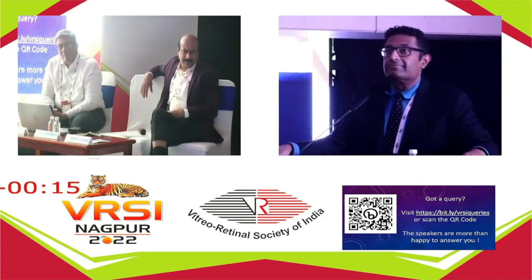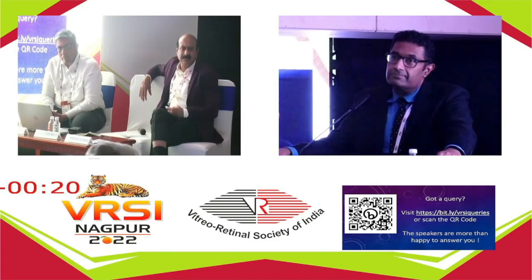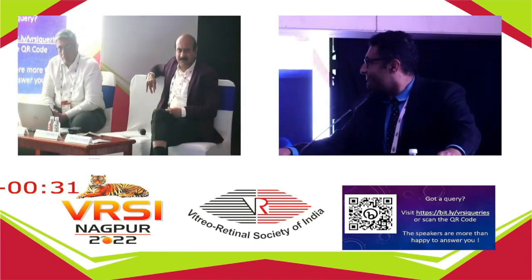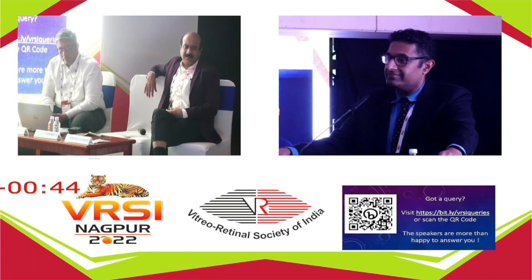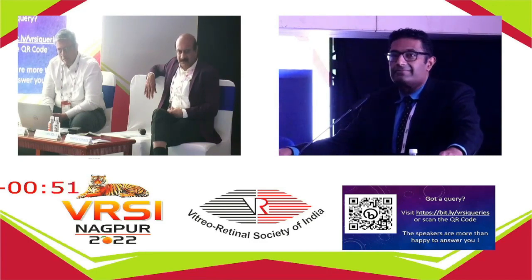One more thing I wanted to tell about this, which was not discussed. Ultra-wide field photography actually uses lasers. For seeing the choroid, it is best, and specifically in the periphery. We can't see the peripheral choroid with any of these machines except this ultra-wide field machine. If we want to differentiate whether the pathology is in the retina or choroid, we can definitely see better in the ultra-wide field modality, which is not possible with a normal one. Even with a montage, we can't see whether it's in the choroid or retina, but here we can see with different modulations.